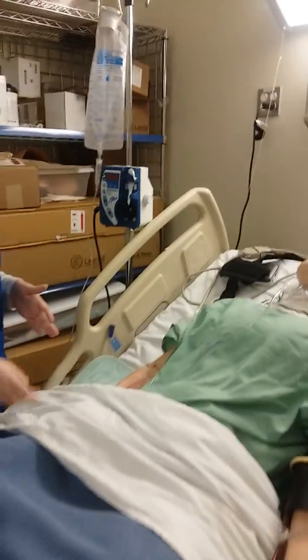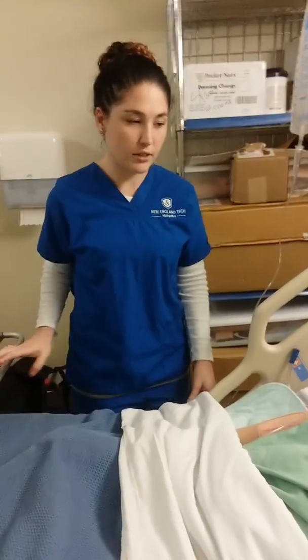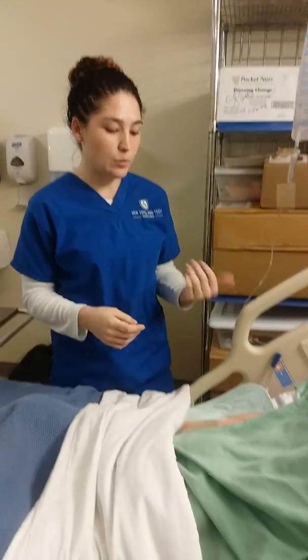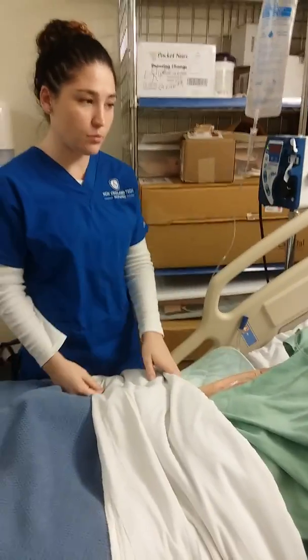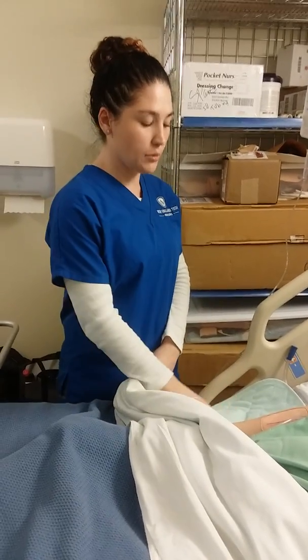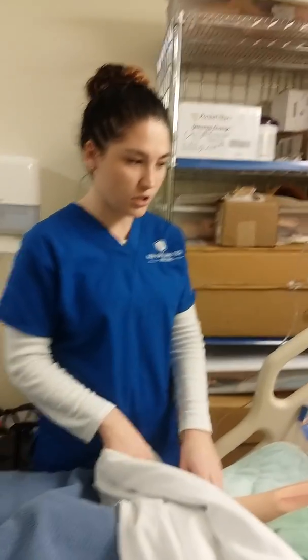Once I'm in the patient's room, I would make sure to have my meds never leave my side, and I would introduce myself to the patient. Hi, I'm Savannah, and I'm going to be giving you medication through your IV port today, and I would make sure I verify my patient using 2 forms of ID. Can you tell me your first name, last name, and date of birth? I would verify that with my patient.